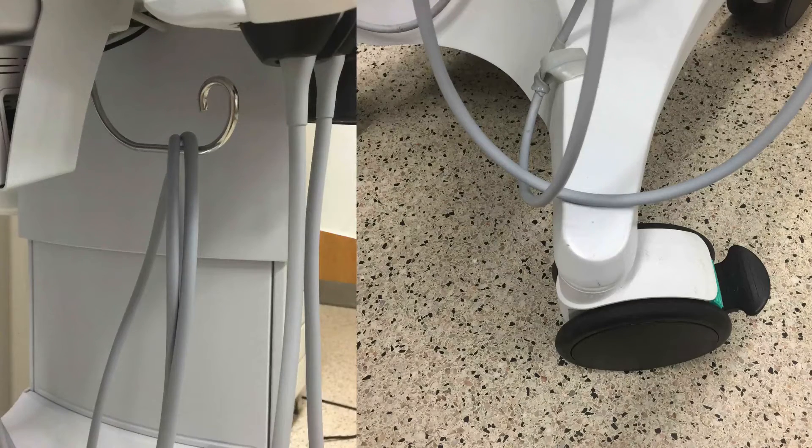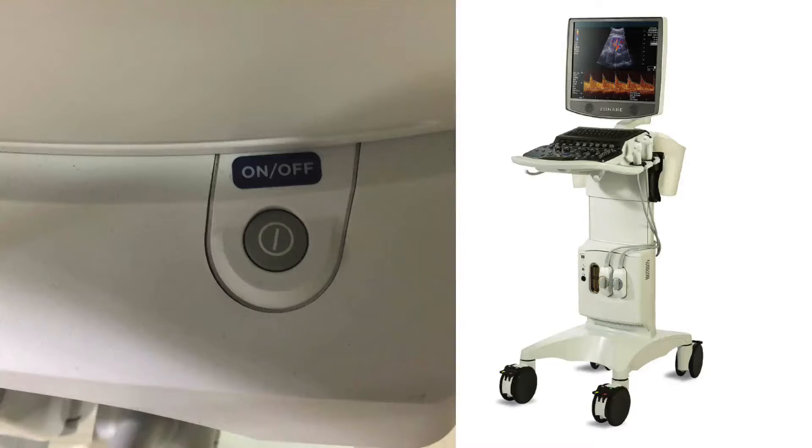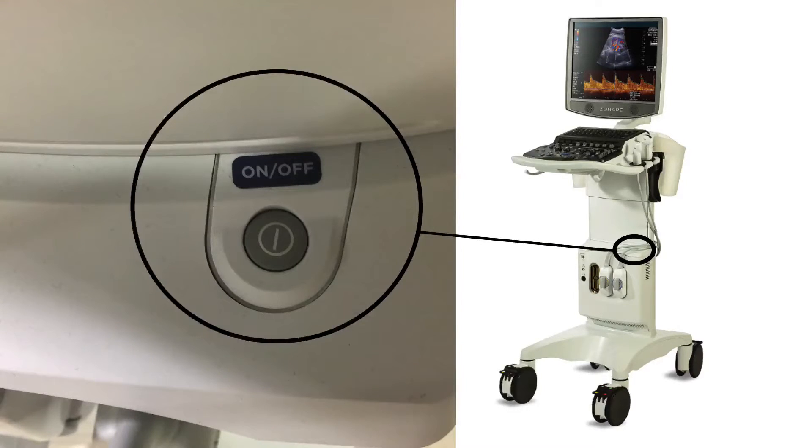If the cords are on the keeper, you still have a good amount of cord play, but the bottom of the cord will not reach the wheel to be run over if the machine is at full height, as it does have an adjustable height. On the outcropping of the system is the on and off button.